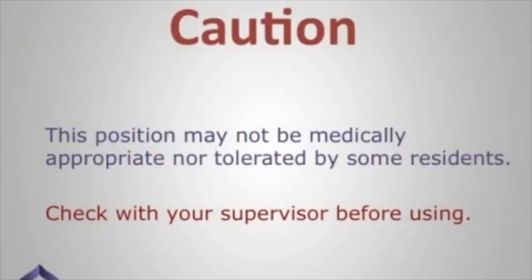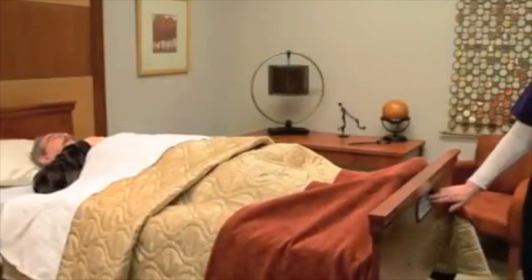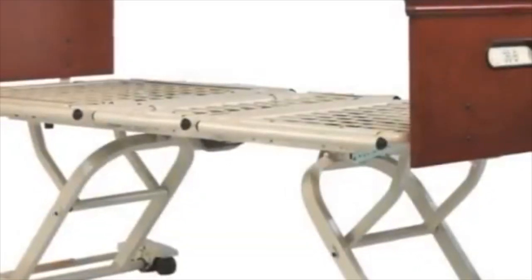Caution: this position may not be medically appropriate nor tolerated by some residents. Check with your supervisor before using. When using Gravity Assist, press and hold the button on the staff control that shows the head in a low position. Once the resident has been transferred up in bed, return the bed to a comfortable position for residents.